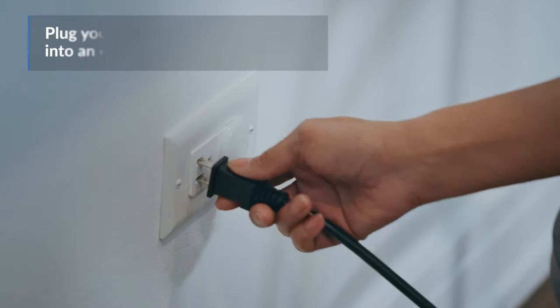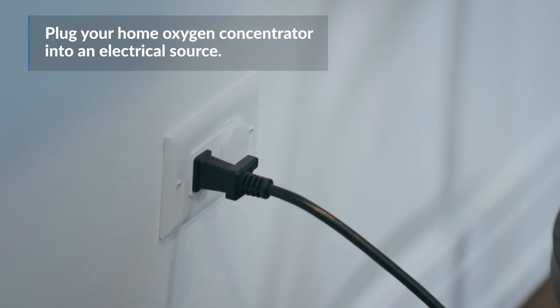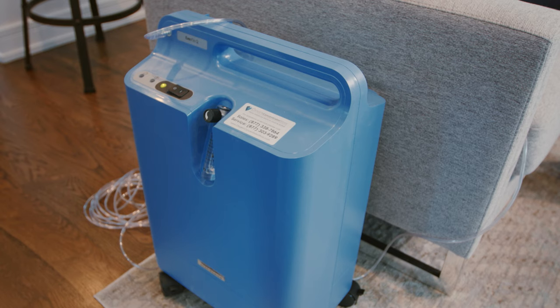Then, plug your home oxygen concentrator into an electrical source. It needs to stay plugged in at all times to work properly. An alarm will sound if it's not plugged in or if there is an abrupt power failure.